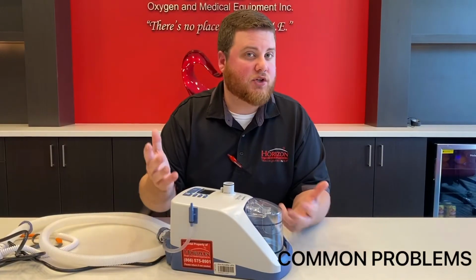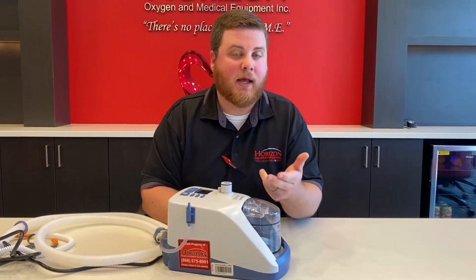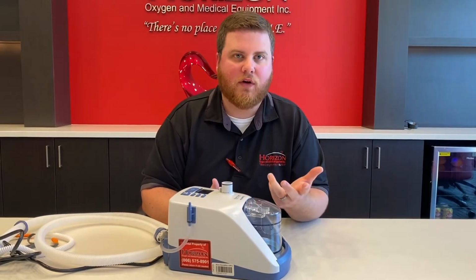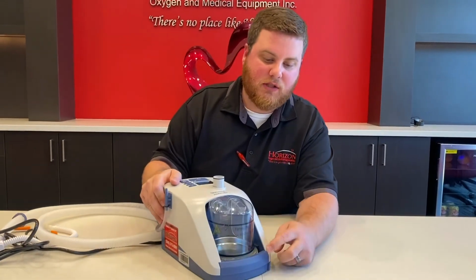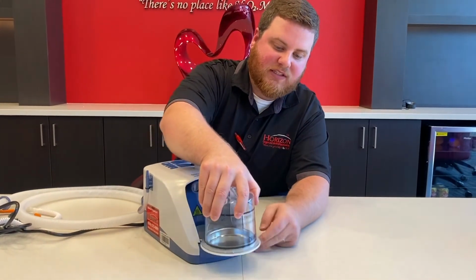Probably the biggest challenge or hurdle for some people utilizing this machine in the home is that they have a hard time adding water to the humidifier chamber. So let's go over how that works. On the front of the machine, there's a little slide. If we push that down and hold it, we can actually slide this whole piece out.